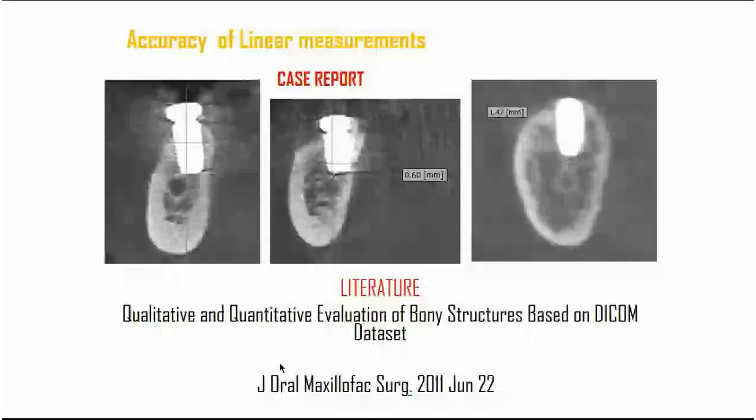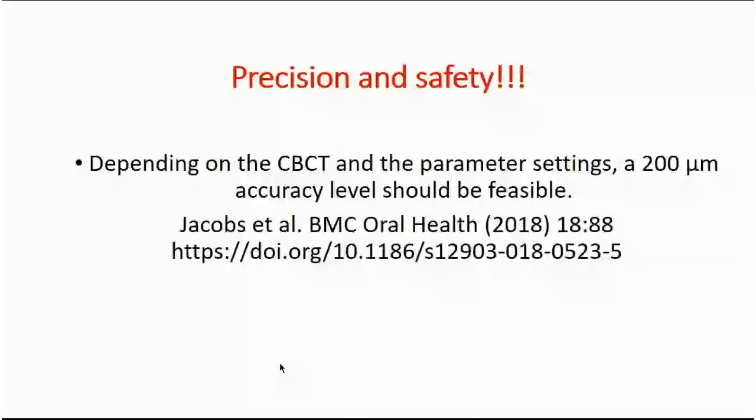The main issue I'm telling is that CBCT is giving us accurate data in which we could believe, and with really careful surgical actions, we really can use the maximum of the remaining biological capacity, or the remaining alveolar bone in our situation.